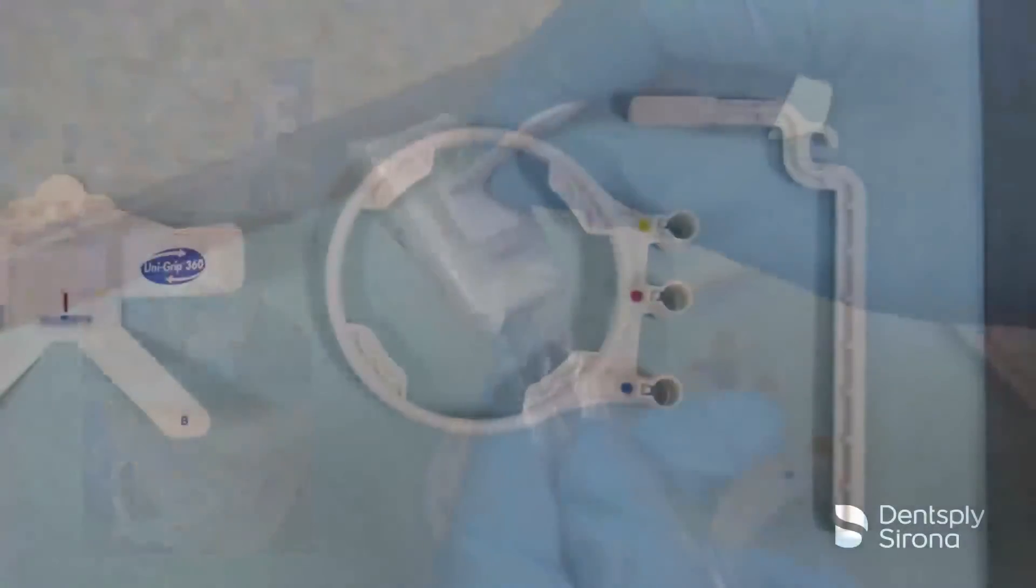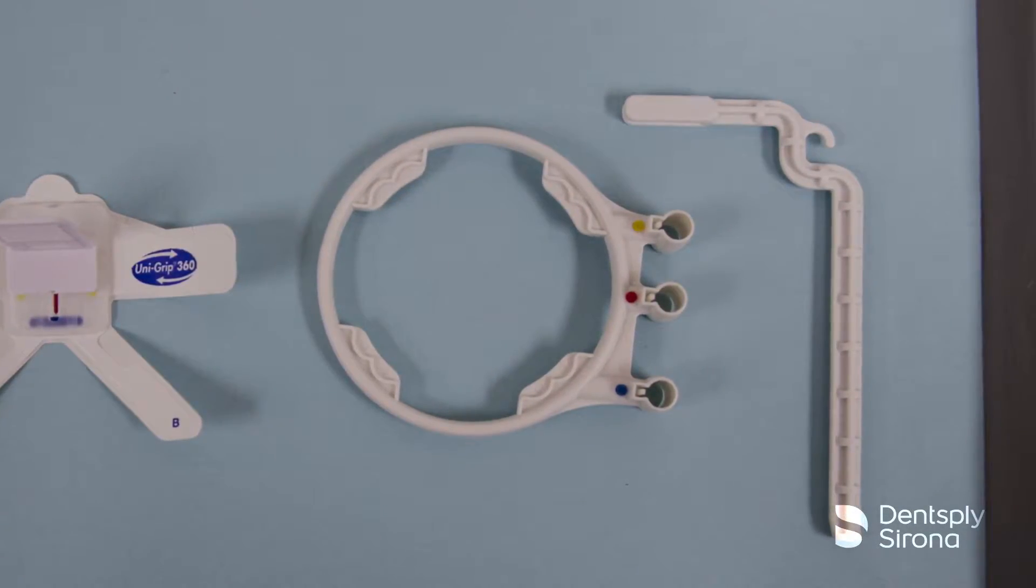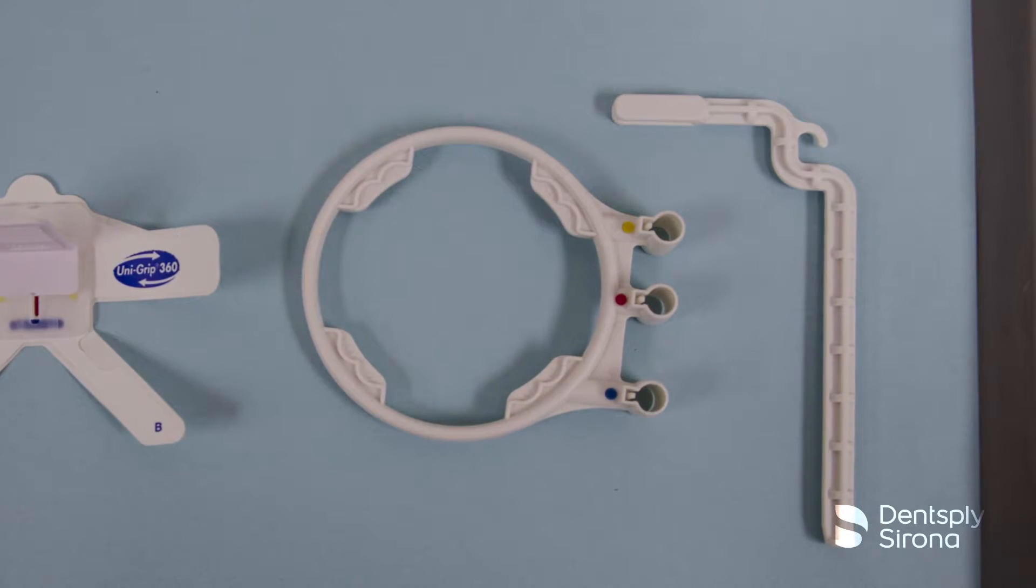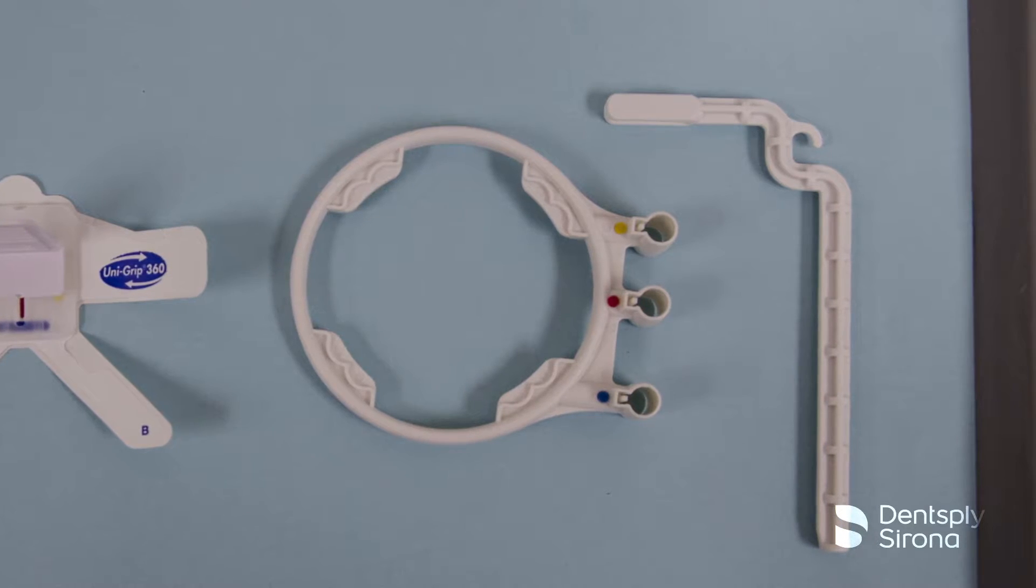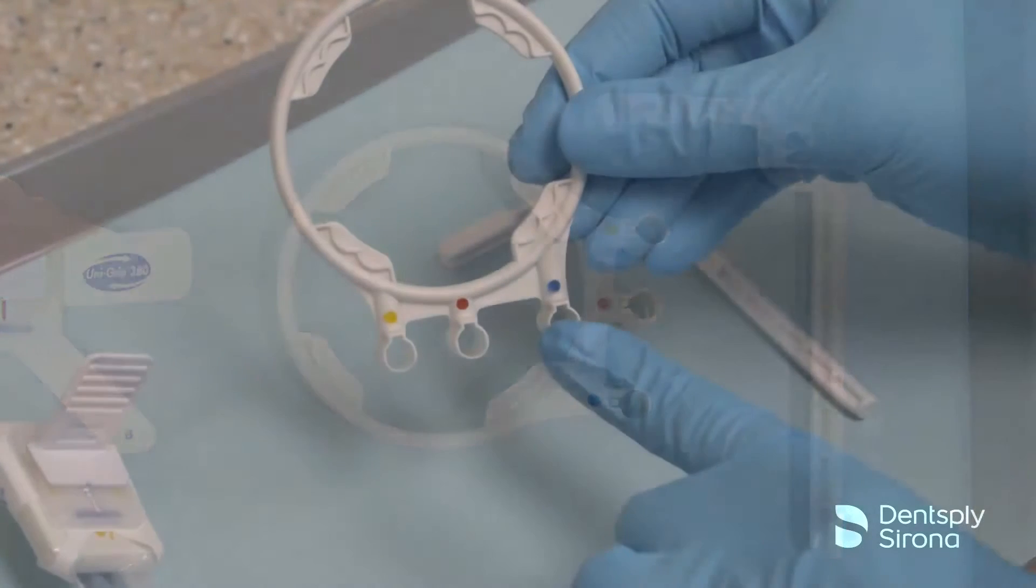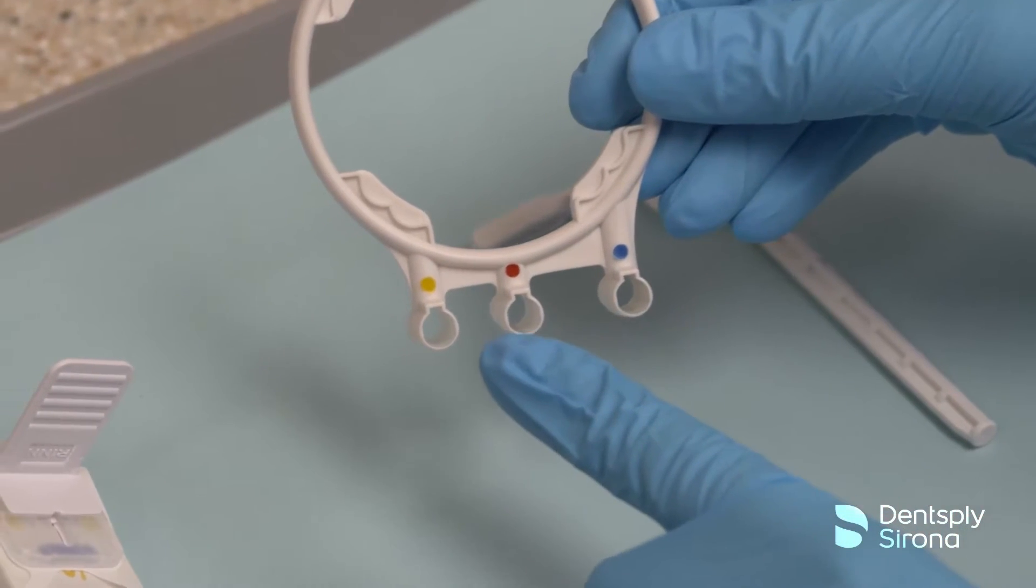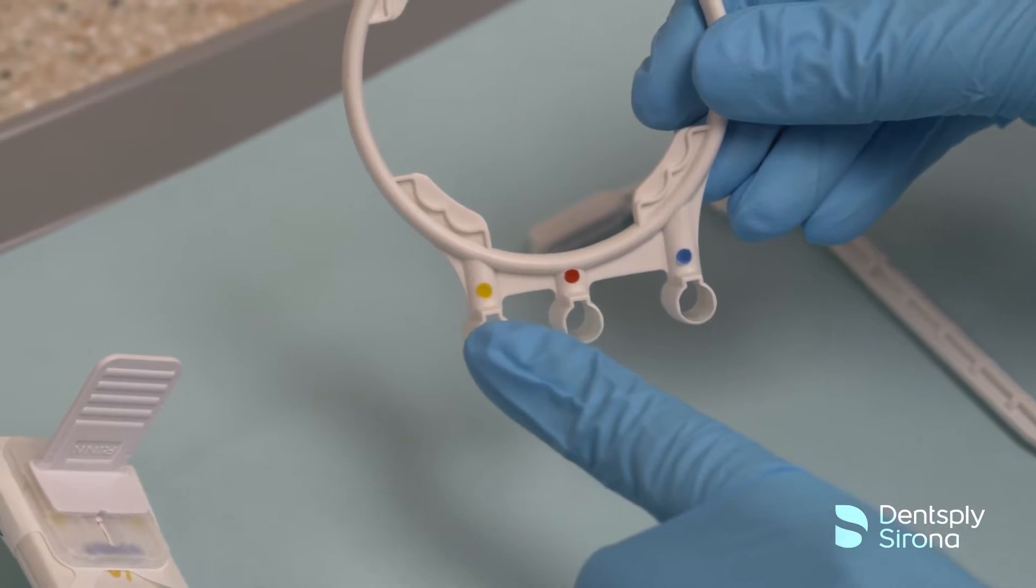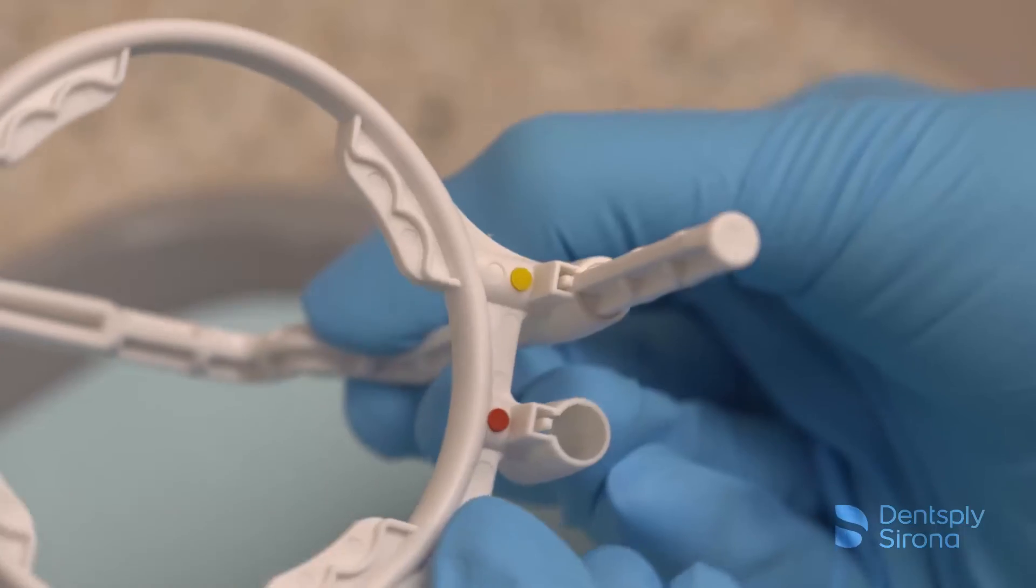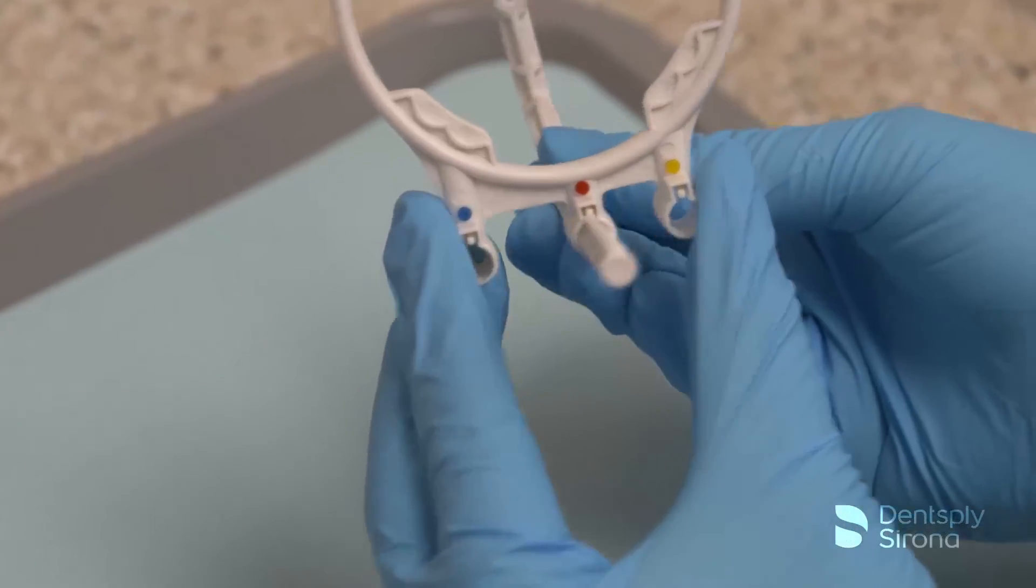The Unigrip positioning arm and ring can be utilized with the Unigrip 360 Sensor Universal Holder. The positioning arm and ring is color-coded for quick assembly to align with the image being captured. The color coding is the same as the original Rinn XCP system: blue for anterior, yellow for posterior, and red for bitewing.